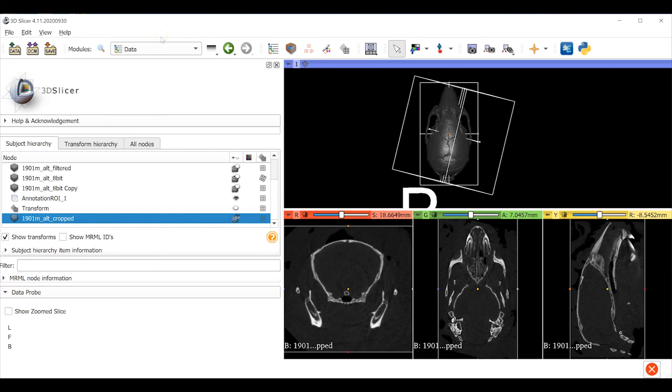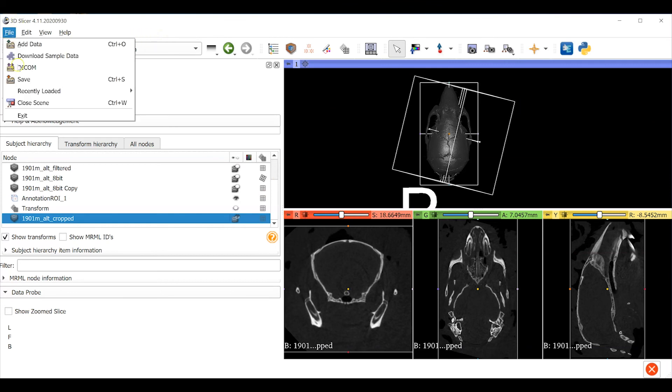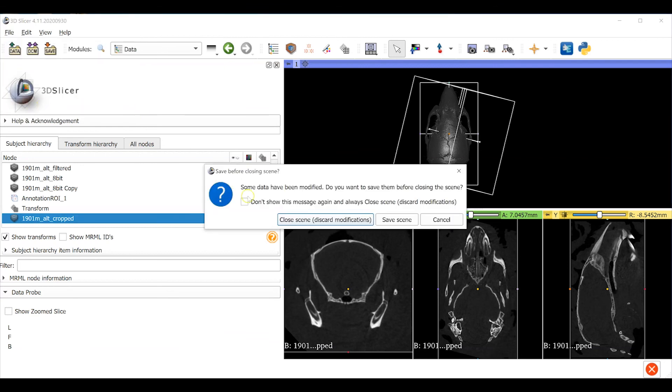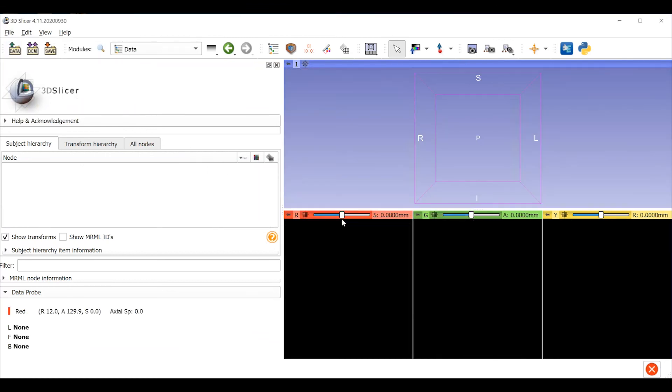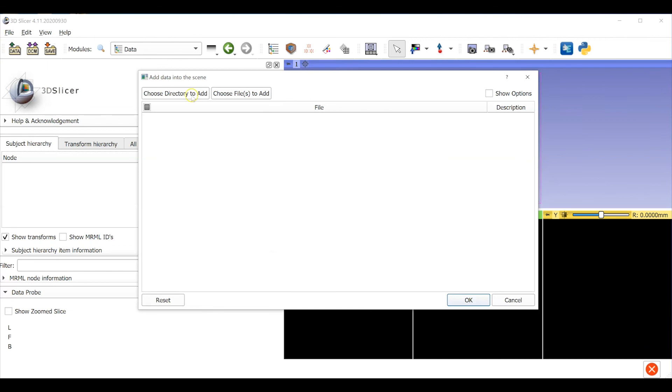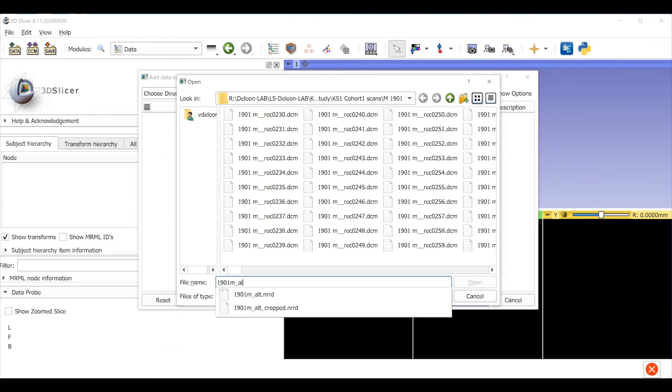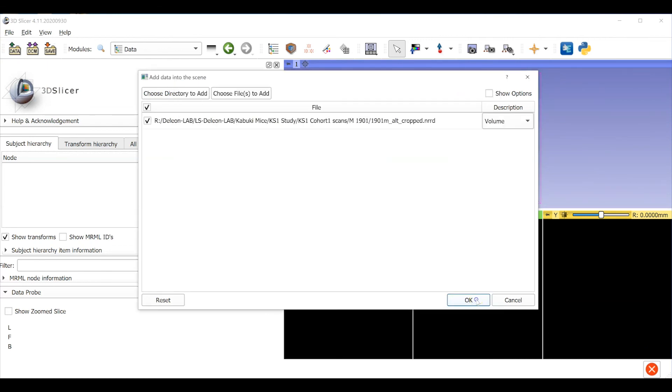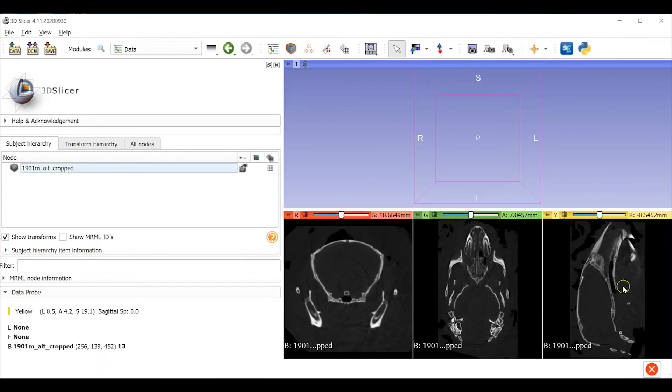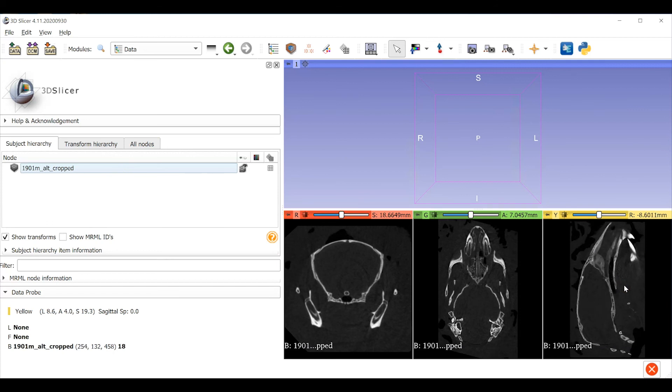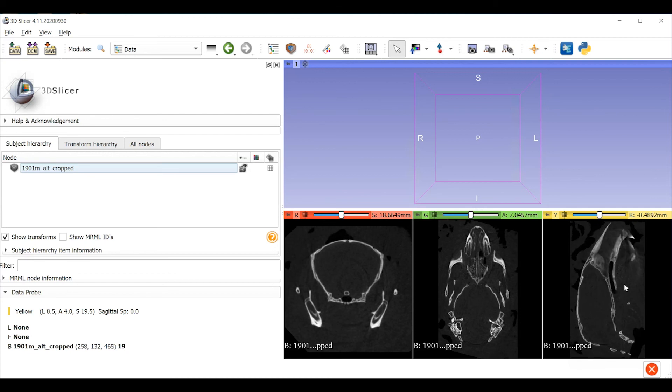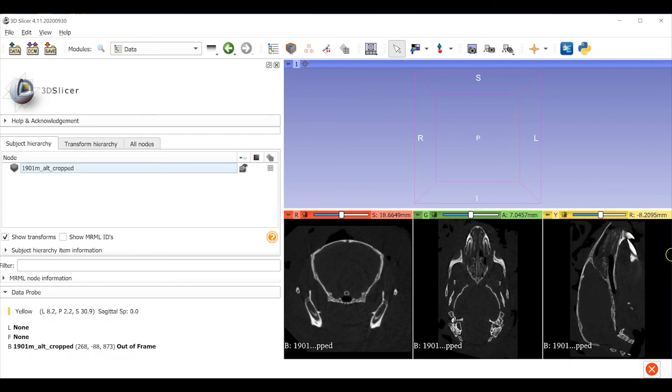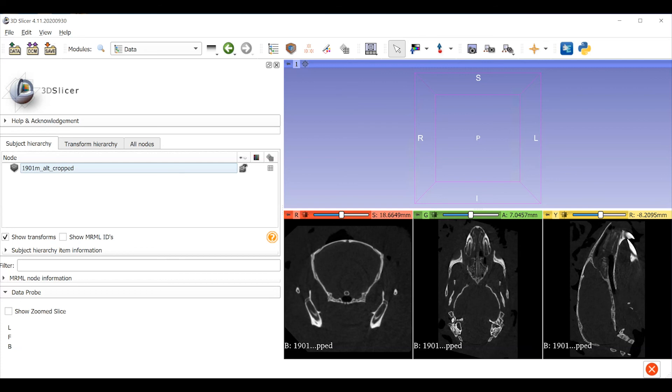You can use the new volume now to collect landmarks or segment structures. But let's close this scene and look at our new image volume from scratch. You can see here that the skull is oriented orthogonal to the planes of the volume and the structures appear symmetric in the 2D windows. In addition, by converting these data in 8-bit format and cropping away all the unnecessary voxels, I was able to reduce the file size of the volume from 247 megabytes to 81 megabytes. This makes it easier to work with this volume on standard computers.